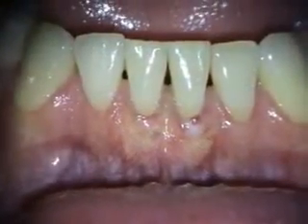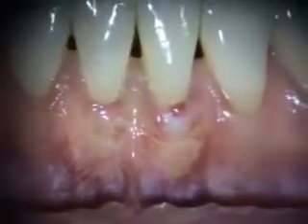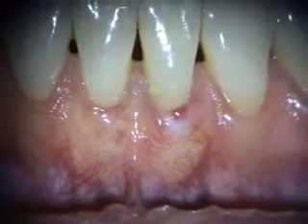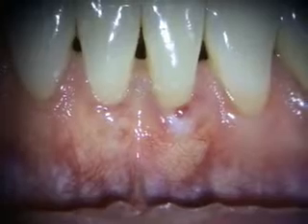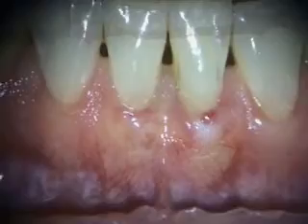Here's the one-month healing of the grafting in 24-25. There was a little bit of show of the alloderm, and you can see the soft tissue is growing into it. We're going to take a look at this in another couple of months.